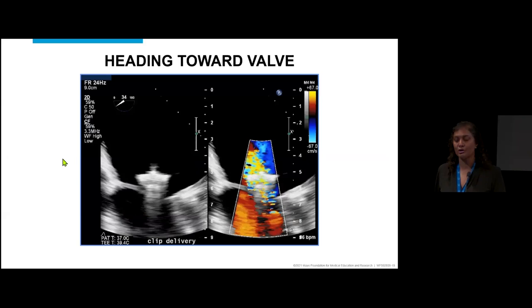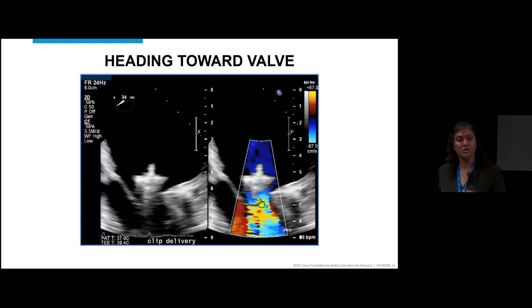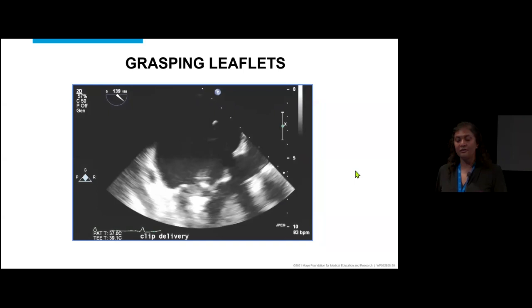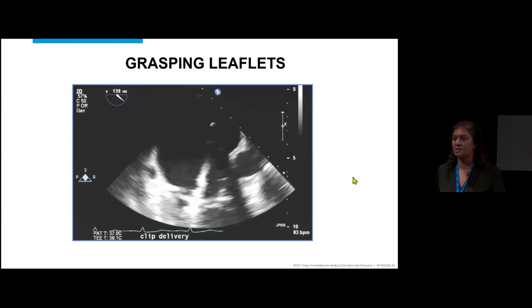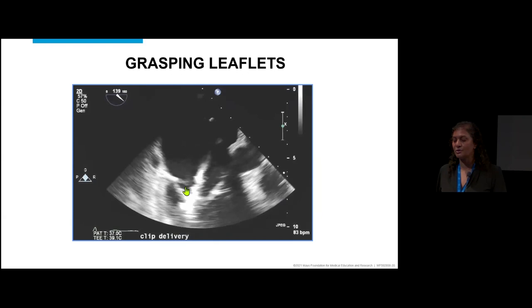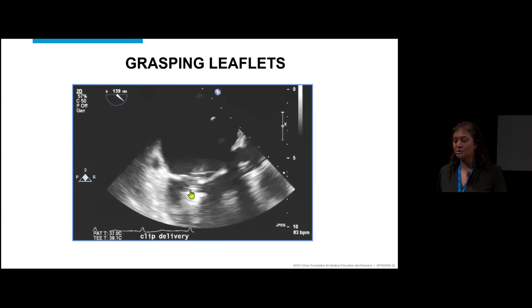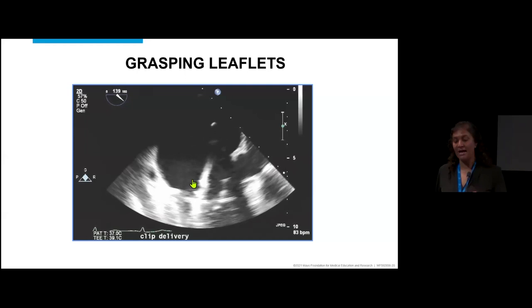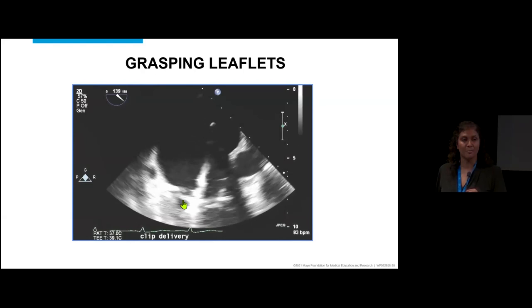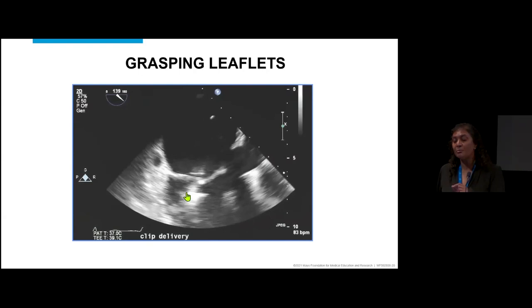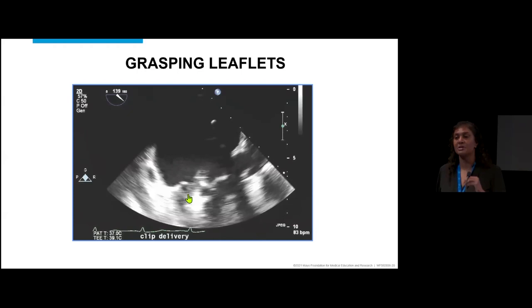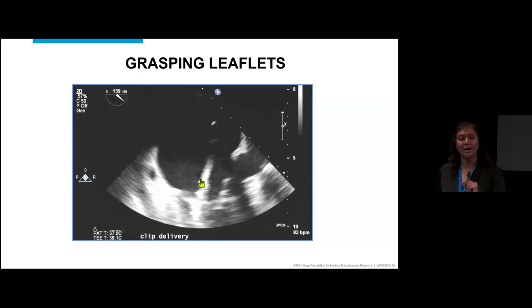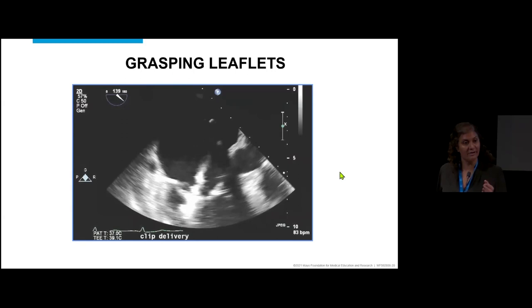As we head toward the valve, we look at where the mitral regurgitation jet is — back to 2D — to confirm we're positioned right where that severe leaking jet is. We always check clip grasping in the long-axis view. We look for the anterior leaflet and posterior leaflet in the grip arms. With the newest MitraClip, the grip arms are independent, so each arm can grasp the anterior and posterior leaflet independently. We guide the operator to confirm both leaflets are appropriately clipped.